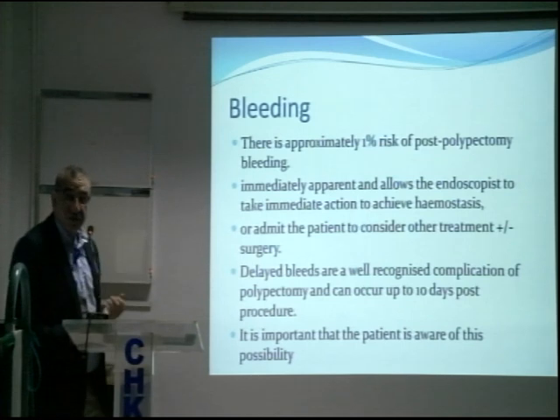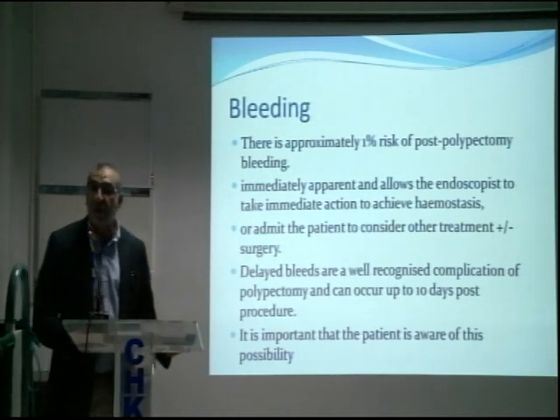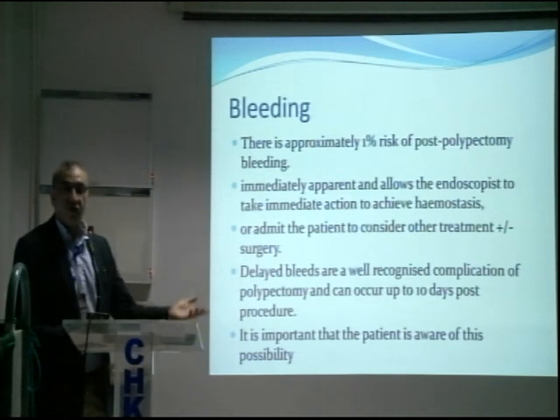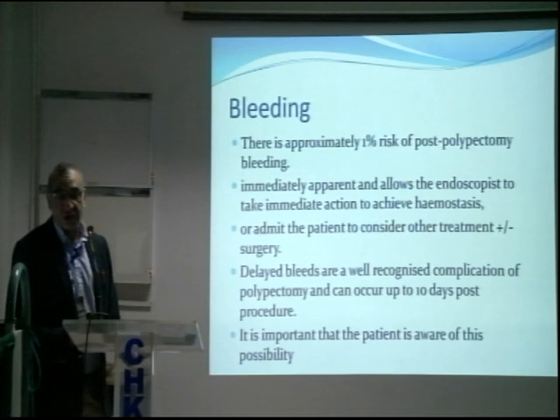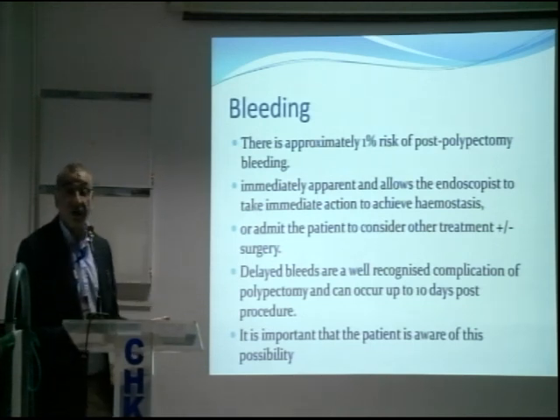The problem is if there is delayed hemorrhage, because that is a well-recognized complication of any procedure, whether it's polypectomy or sphincterotomy in ERCPs. The patient is fine, nothing happens, goes home. A week or a few days later, he comes with a massive hemorrhage. And that is well recognized. You should warn the patient about it as well.